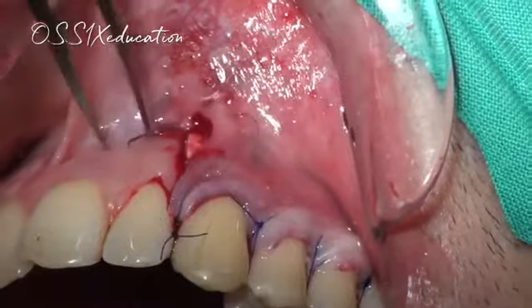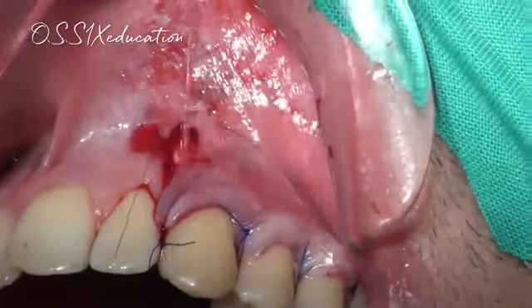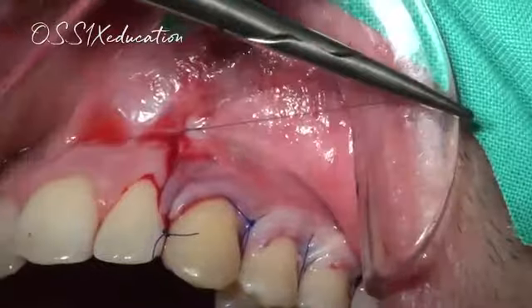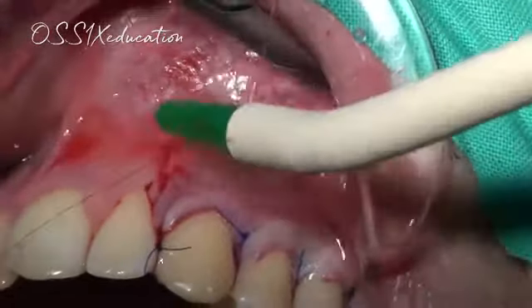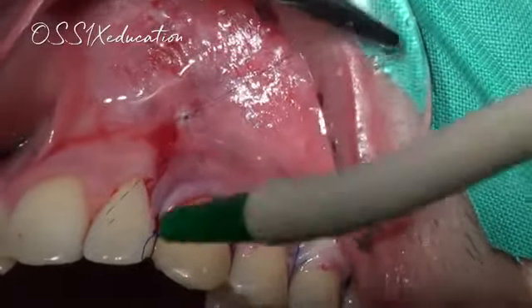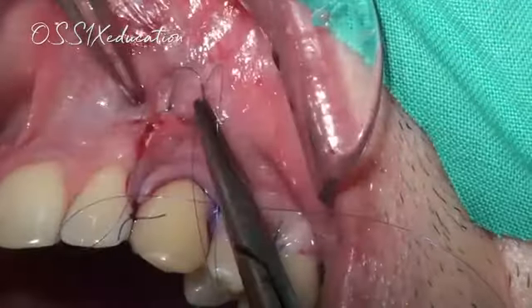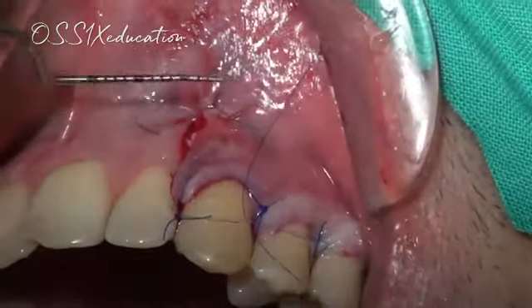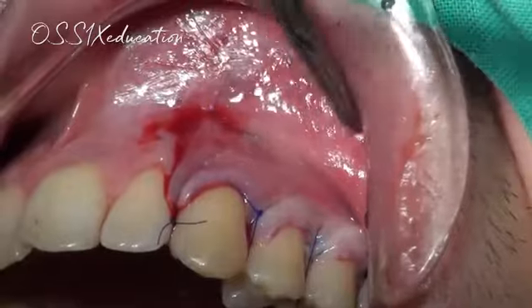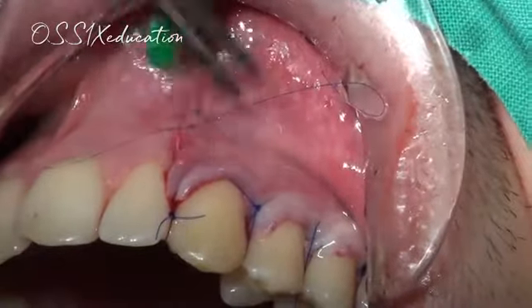So the thing we're left with is the vertical releasing incision. And we will close it with single interrupted sutures. So you want the knots to be a little bit in a coronal position. So you want the knots not to be horizontal but to be in this direction, so that it pulls the flap in a coronal position. That's what you want.